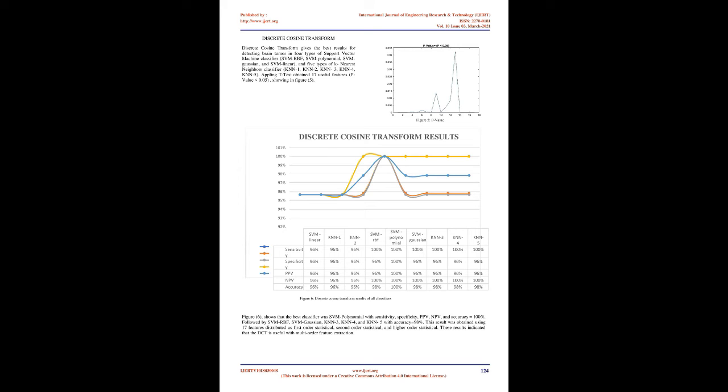This size was a result of many experiments where original image sizes were implemented, but algorithm performance was best observed with lower size samples. ROIs were subjected to two different transformation techniques, which are radon transform, RT, and discrete cosine transform, DCT.